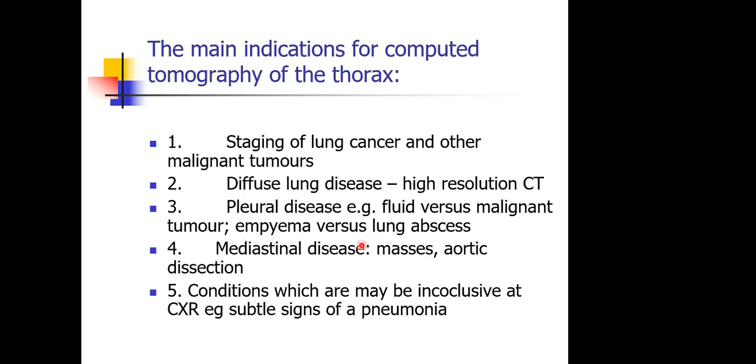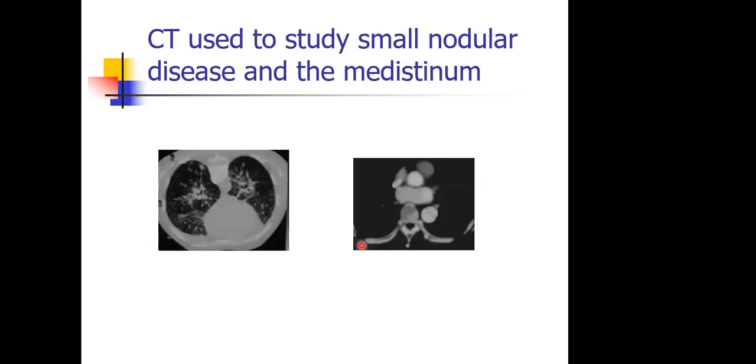when it comes to CT of the thorax. When we are looking at these CTs, we are commonly presented with two sets of images, one of them being a mediastinal window. And when you have to look at it, you really have to look through all the slices.